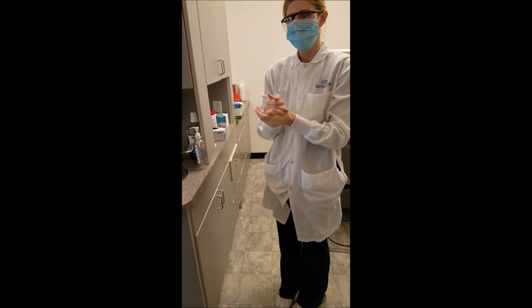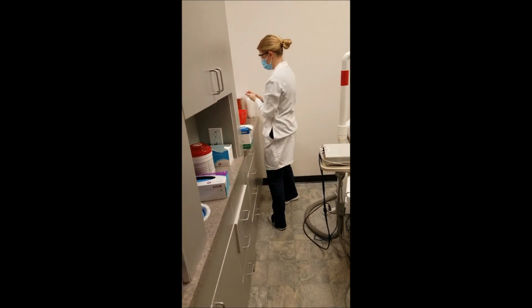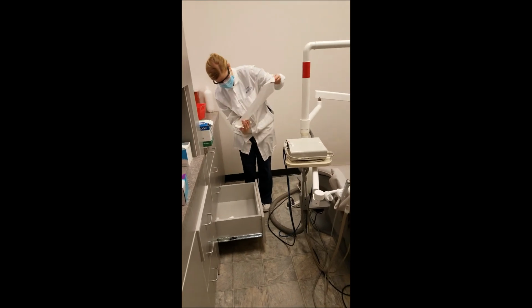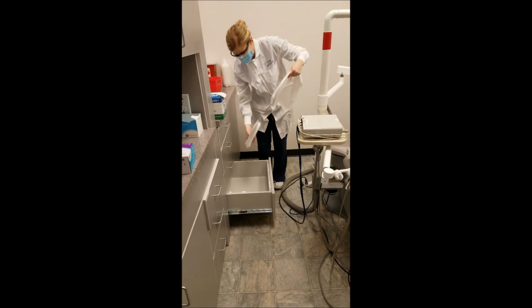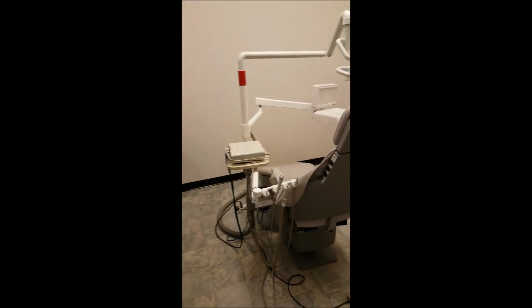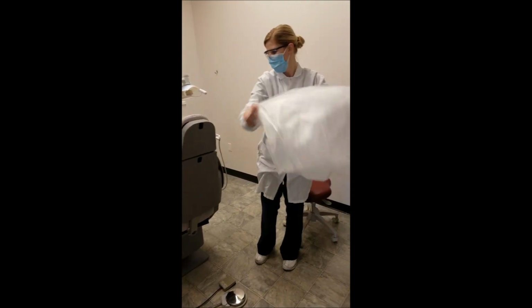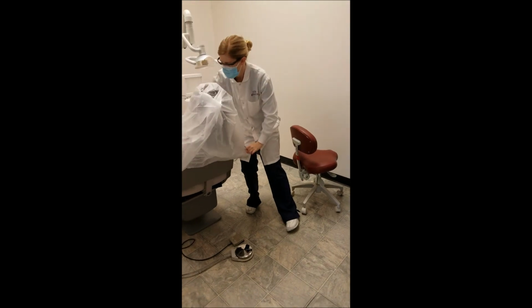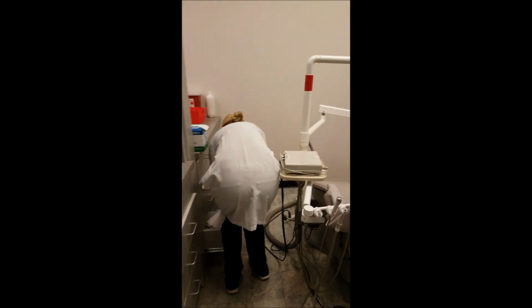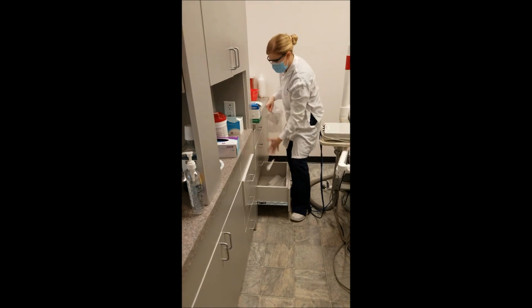And then she will begin to place barriers on all the surfaces which may be contacted during clinic procedures, including the patient chair headrest. And another helpful hint is when she's shaking out this bag, she's going to make sure it doesn't touch the ground before she puts it on. And then she made sure the chair back and adjustment controls were covered, and then she will be doing the operator chair back.